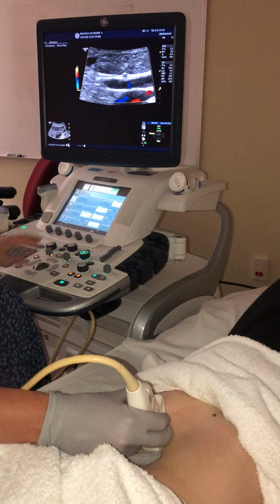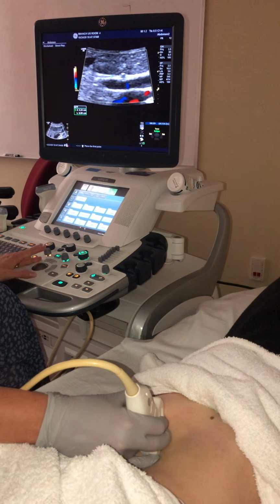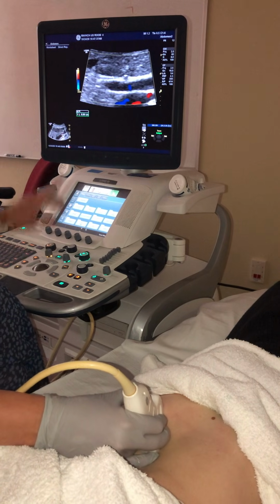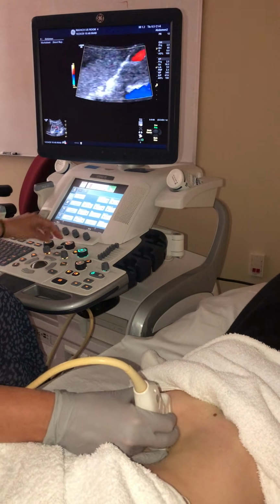portal vein. Different than the gallbladder wall measurement, we measure this inner to inner. So we're going to measure from the inside portion of the echogenic wall to the inside portion of the other echogenic wall. So she is at less than a millimeter for her common bile duct. So that's fine, that's normal.